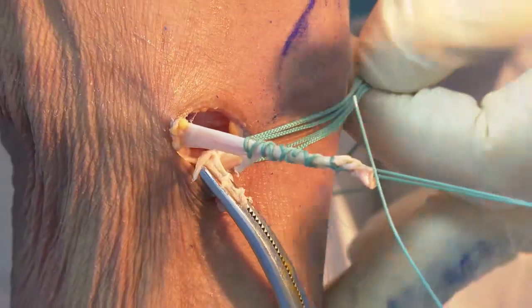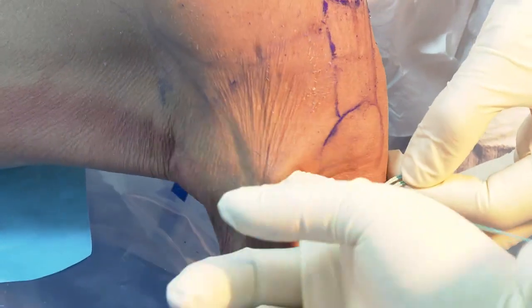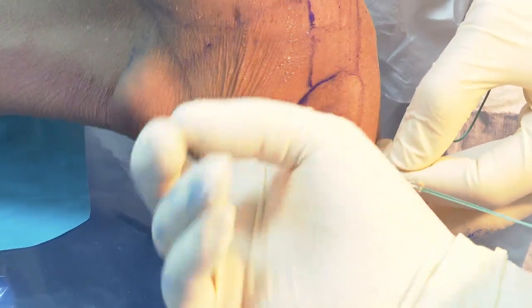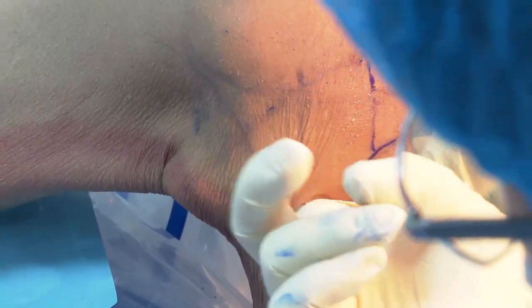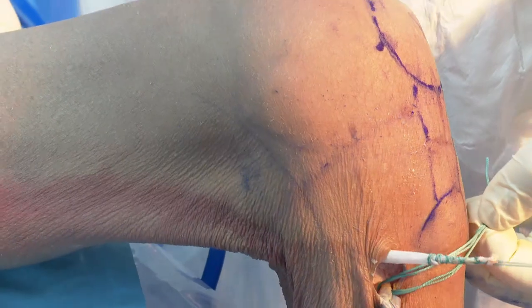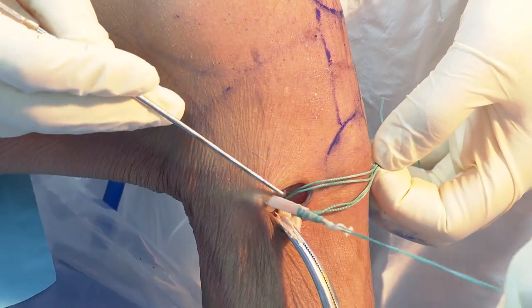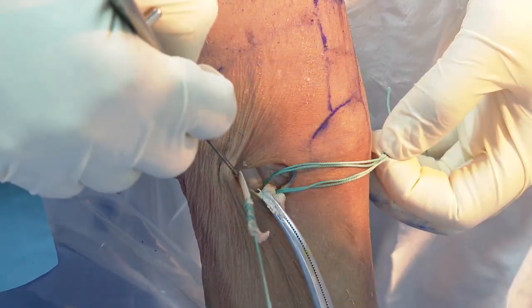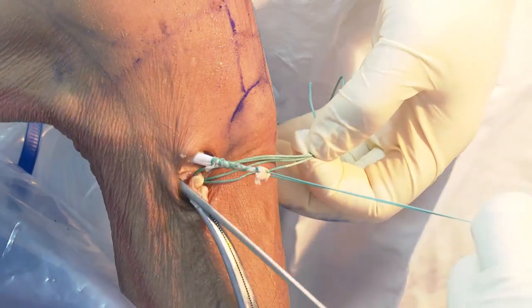Okay, the first tendon is done like this. Yeah. If there's some branch, sometimes there's a small branch, you just cut it, okay? Just cut it directly. Okay, good. And then, put your finger in like this, and use the finger to strip it. Always use your finger, okay? Just the finger is enough. Make sure that there's no attachment. A finger is very, very good friends. And also, you have no injury from the fingers, okay? So until you feel the muscle here, that means there's no more branch, okay? Sometimes the gracilis has one small branch. Usually there is none, or just one branch; once we separate by hand to the muscle portion, we can be sure there are no other branches.